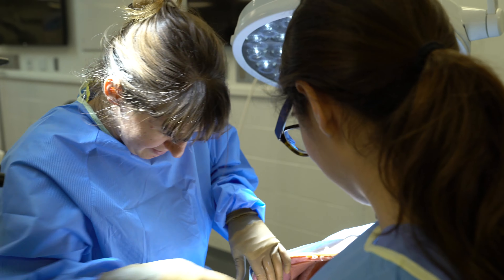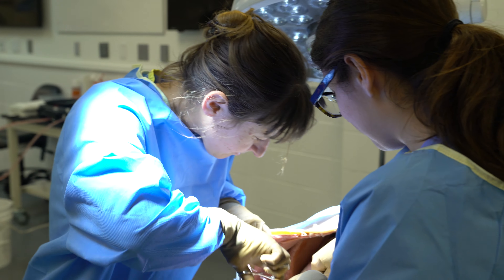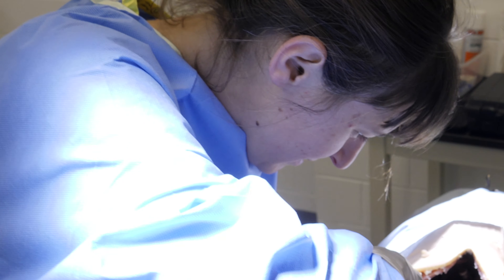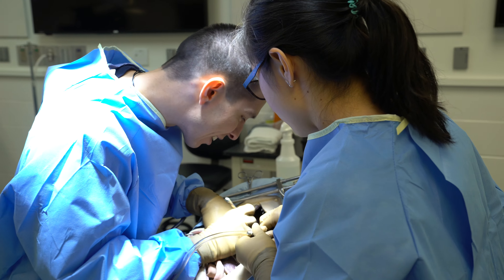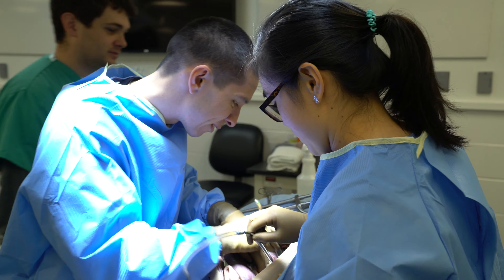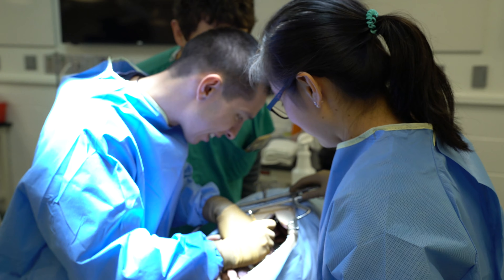I'm going to check here — oh, there it is. And your patient's heart rate is 180 beats per minute. And this stupid hemostat is not working. We're up to 200 beats per minute. It's going to go into cardiopulmonary arrest.